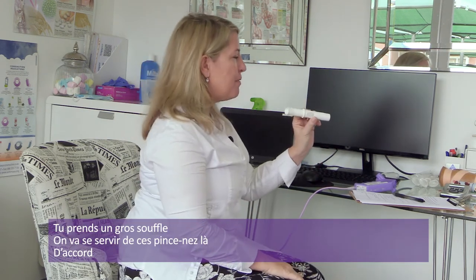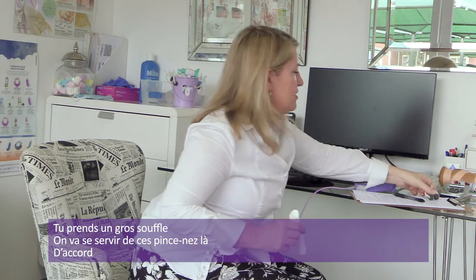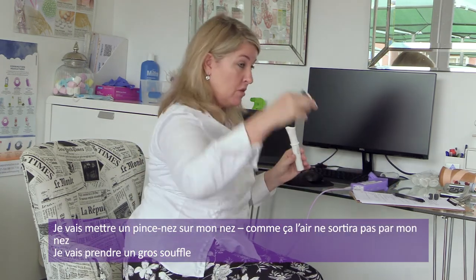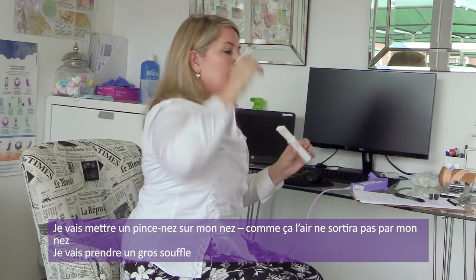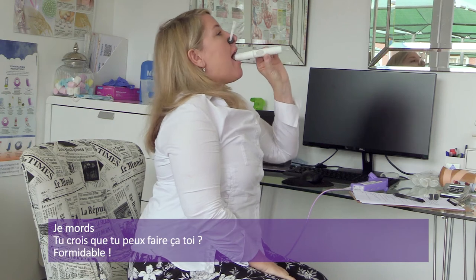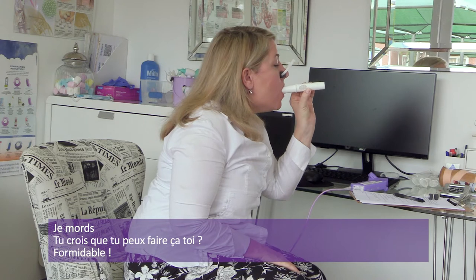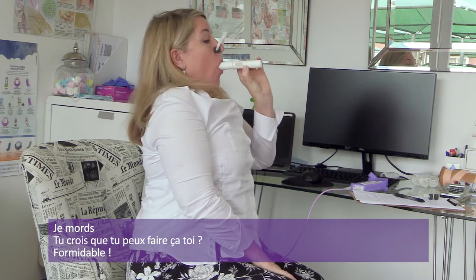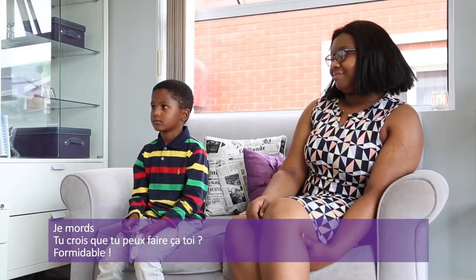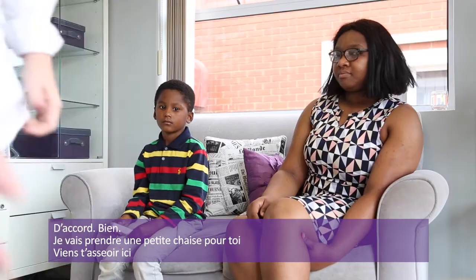All right, so you take a deep breath in. So let's just use some of these nose clips here. Okay, so what I'm going to do is put a nose clip onto my nose so the air doesn't leak out of my nose. I'm going to take a deep breath. Bite. You think you can do that? Excellent. All right, good.